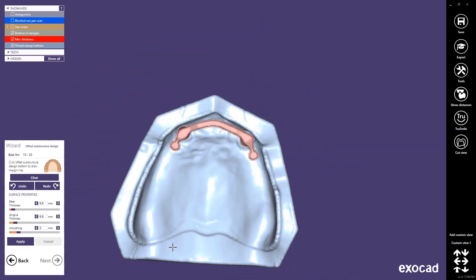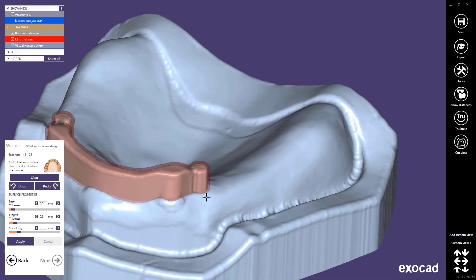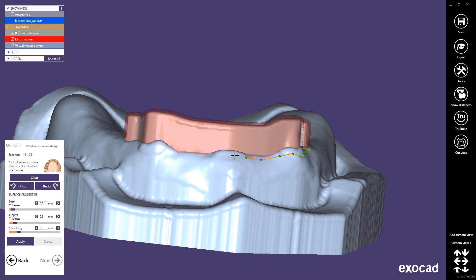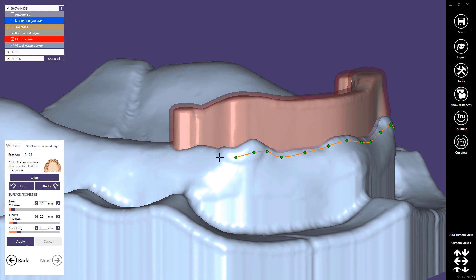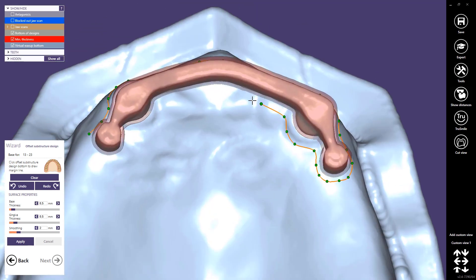In this step we have to define the offset substructure itself. We have to define it with a spline. Please click on the model to define the offset substructure. Please double-click to close the spline.